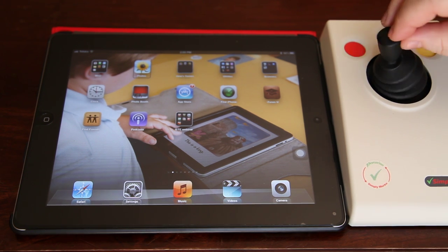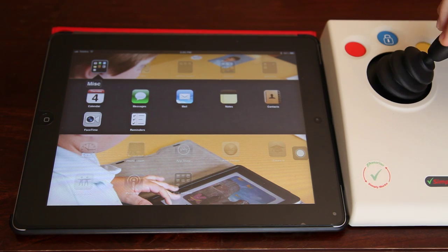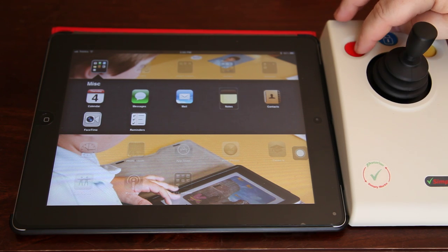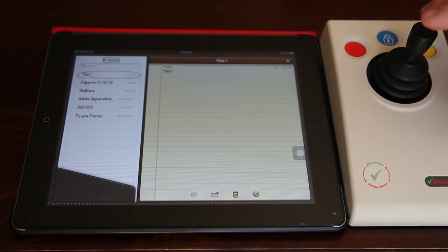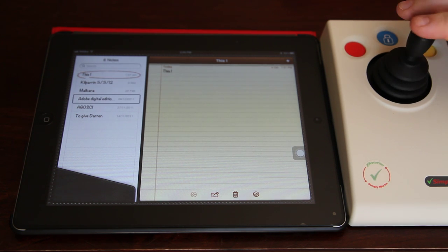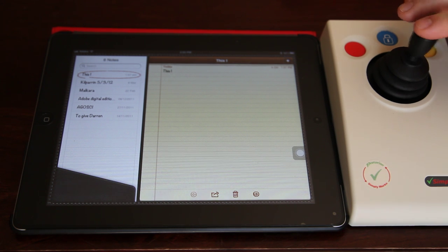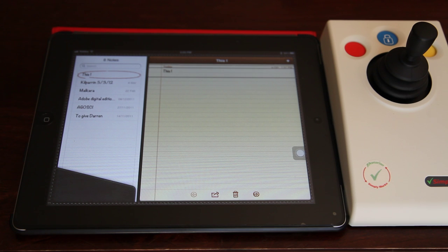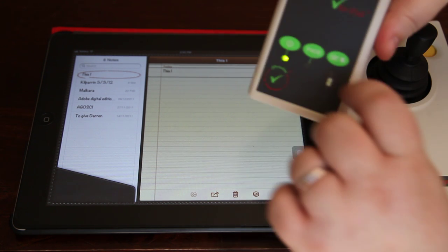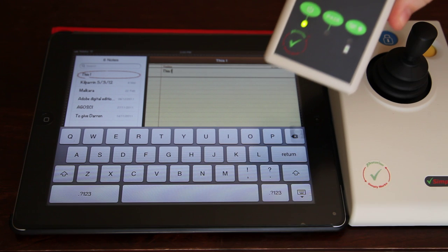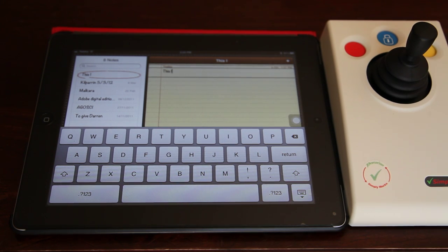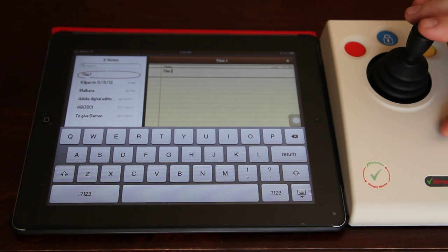If I go and launch another app — I'll press the red button and I'm going to go to the Notes app. I need to press again to move between items to get into text editing. I press select. Now I'm finding the keyboard sometimes pops up at this point and sometimes it doesn't. There is a button on the SimpliWorks interface that gets the keyboard to pop up. Once I've pressed that button, I usually find for the next few times the keyboard pops up fine. However, that is a time where someone might need to come in and facilitate the user's use of this to get the on-screen keyboard to appear.